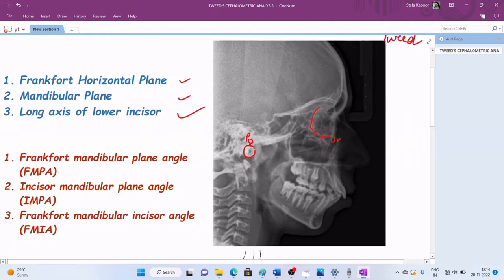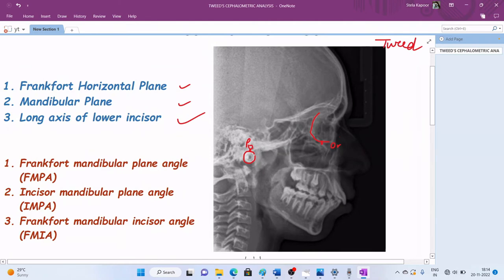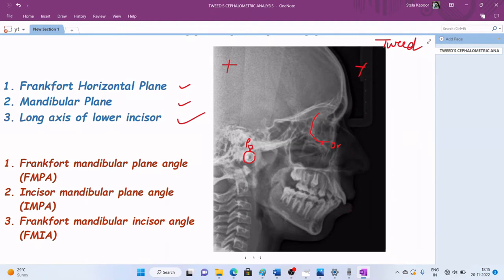Whenever we start hand tracing a cephalogram, it becomes important to mark or etch the radiograph at three points. So whenever we overlap it with the sheet and replace it, we are able to make out the exact position on which the initial points were marked.